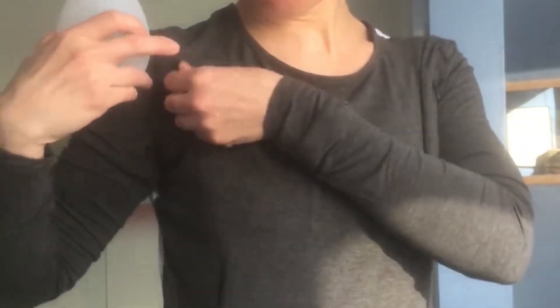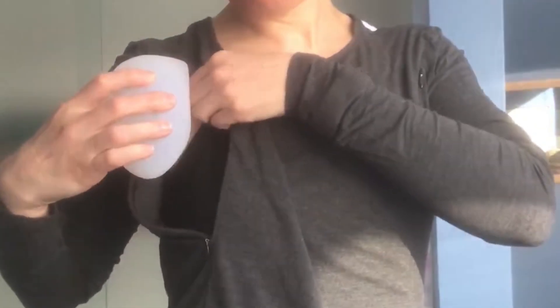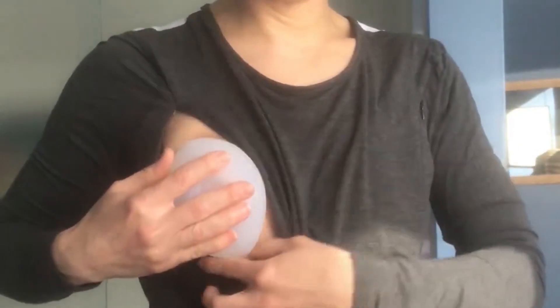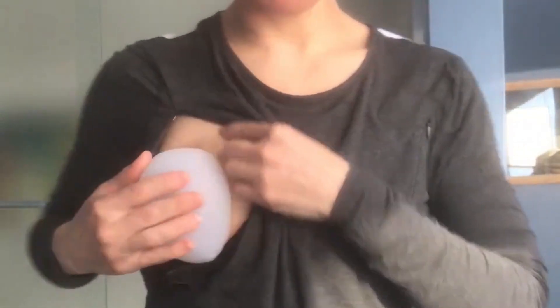First, line up the opening of the cup with your breast. Make sure that there's no fabric in between the rim of the cup and the skin of your breast.